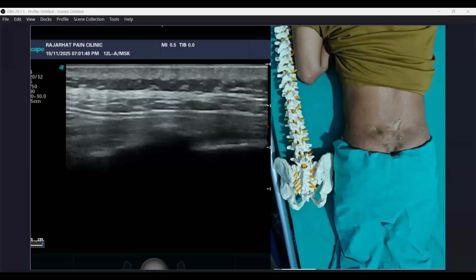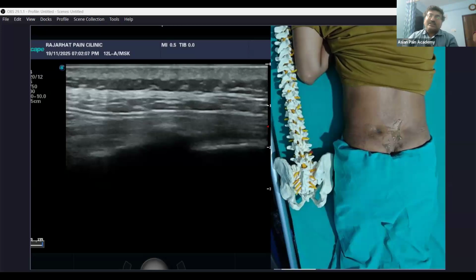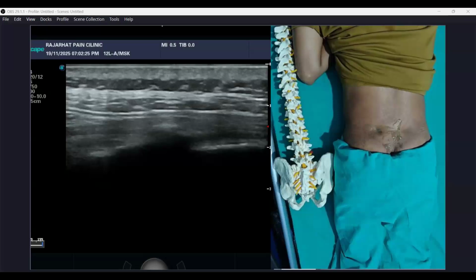Sir, when we are doing caudal ultrasound assisted and contrast guided, then we have the 15 to 20 ml of volume. In that case, you are moving up. You are going at the level of the lower border of the S2, and then usually 10 ml is good enough for lower two levels. If you want to reach higher levels, then you have to give more drug, but otherwise the 10 to 15 ml or 15 to 20 ml, at the lower part, that is not required. Okay. Thank you. Okay, fine.